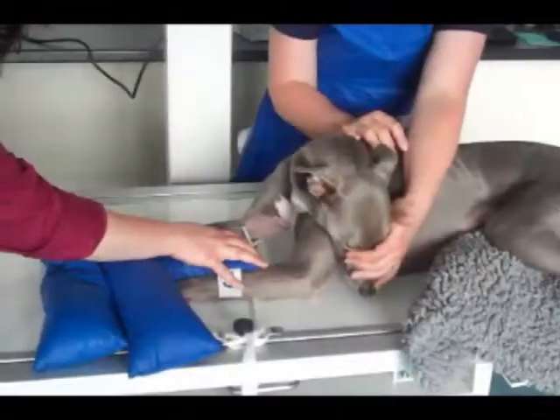We've placed our patient in sternal recumbency, ensuring that the thorax is straight. We then need to make sure that the olecranon is not poking out laterally in order to get a really clear craniocaudal view.